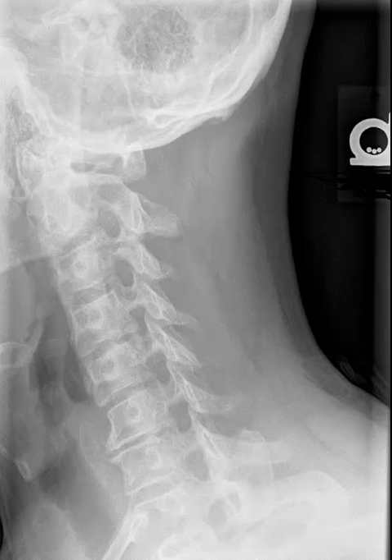Good afternoon and welcome back to our radiology tutorials. Today we're going to cover cervical oblique projections. Cervical oblique projections are taken to see the intervertebral foramen, or the IVFs, in the cervical spine.